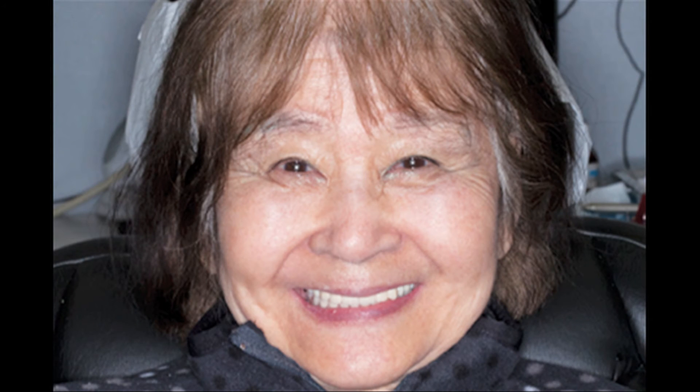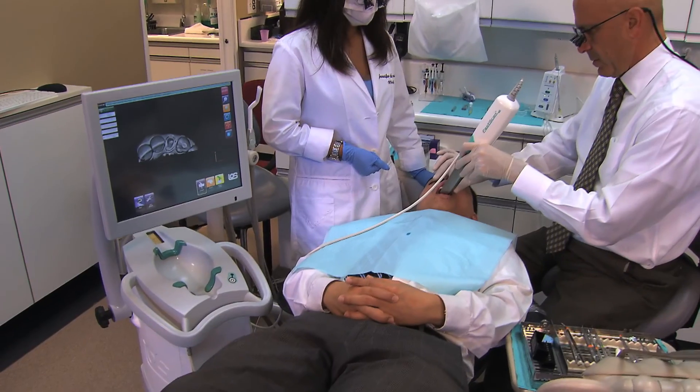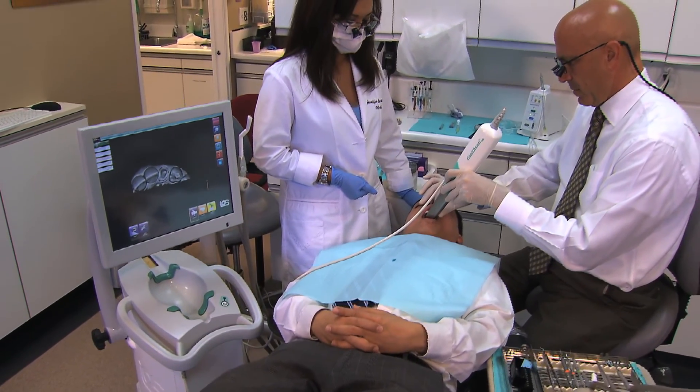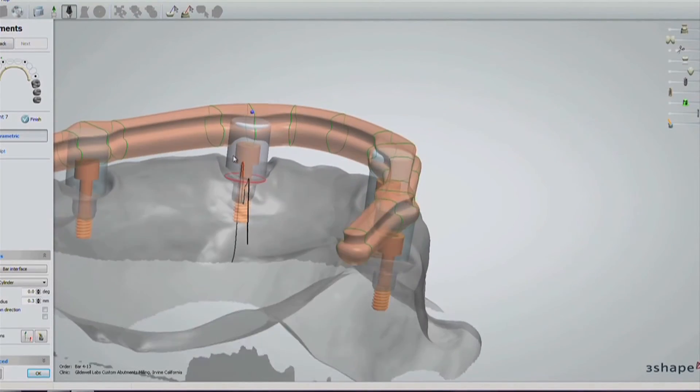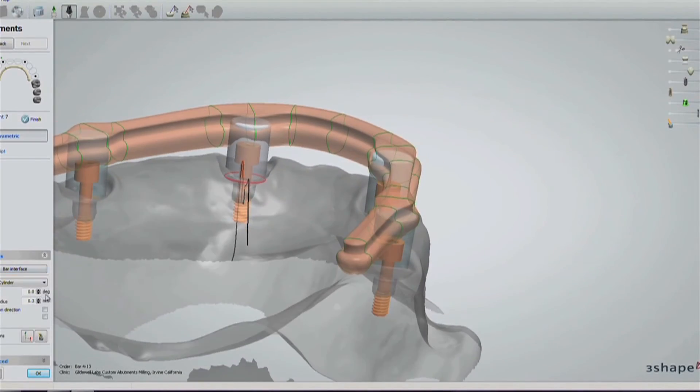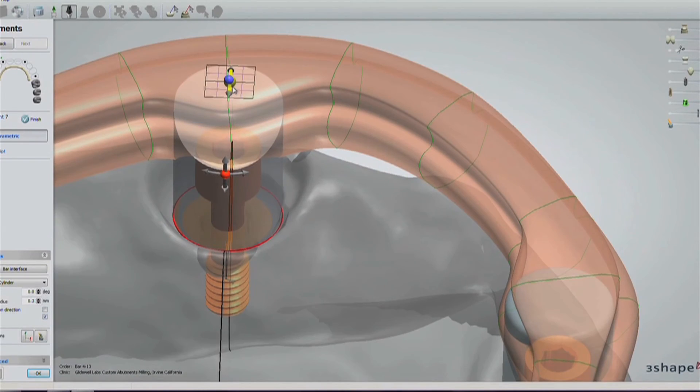The lab processed the denture to the titanium bar with acrylic and the final prosthesis was finished. The provisional was removed and the final fixed implant denture was delivered. The patient was extremely happy with the fit, comfort, and function of the final prosthesis. Advances in intraoral scanning and dental CAD-CAM technology are enabling new treatment protocols that shorten treatment times and improve prosthetic outcomes.